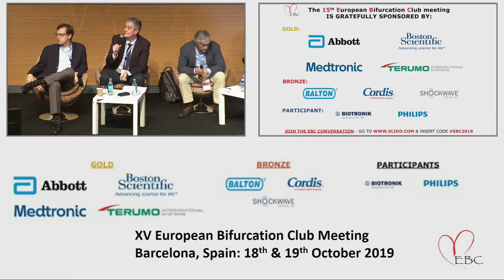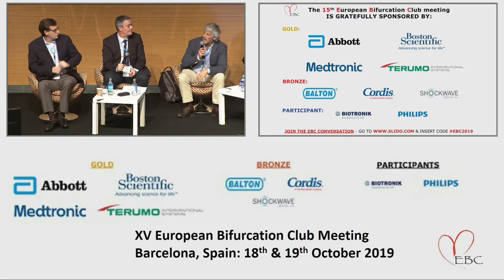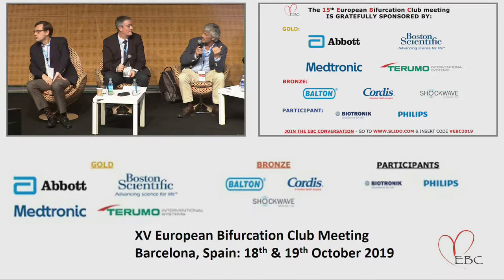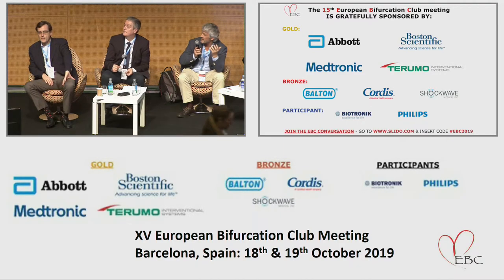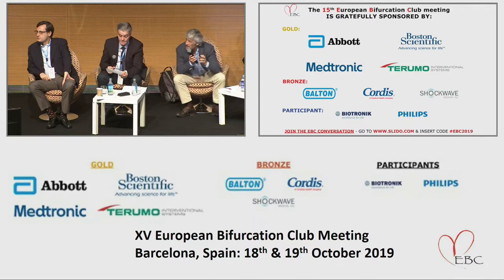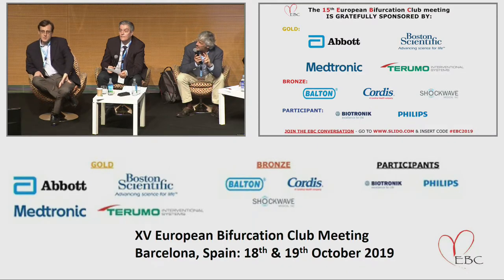Thank you very much. We always learn a lot from trends and from the COBIS registries. I have one question for Dr. Don. In the group with two stents, you presented the independent predictors for outcomes, but I didn't see the use of imaging. I didn't see IVUS among the predictors in this very vulnerable group. Now it's the most complex setting, so you would expect imaging to play a more prominent role. And in fact, in our registry in Spain of left main disease, the greatest difference with IVUS guidance versus no IVUS guidance was in the left main lesions treated with two stents. Do you have any explanation or consideration about why imaging was not an independent predictor among those treated with two stents?